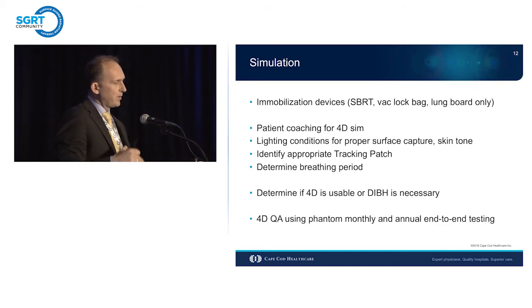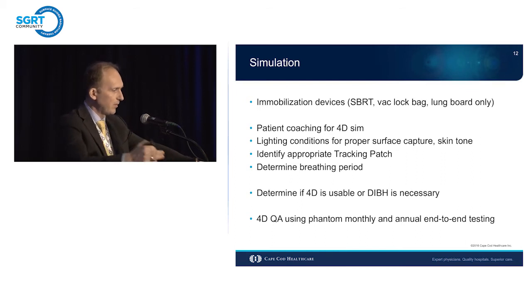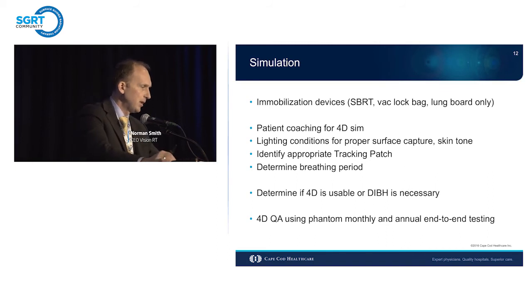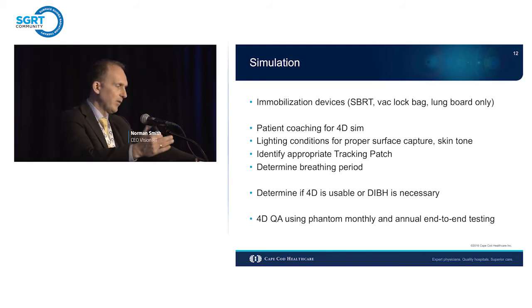So how did we move on to breath hold? Most of the lung lesions that are in the upper part of the lung will not move sufficiently enough that gating or breath hold is indicated. But as you get closer to the diaphragm, all those motions are magnified. So in our clinic, we decided to apply a 1 centimeter cutoff, which means after performing the 4D simulations, if the lesion moves more than a centimeter, we're just going to move on to deep inspiration breath hold, as long as the patient is capable of doing that.